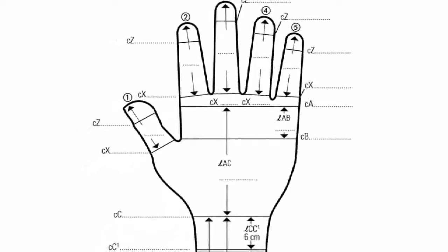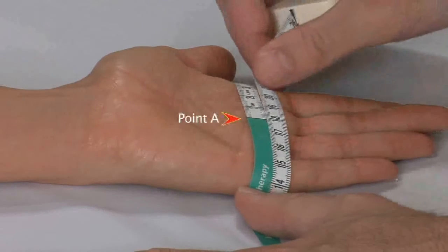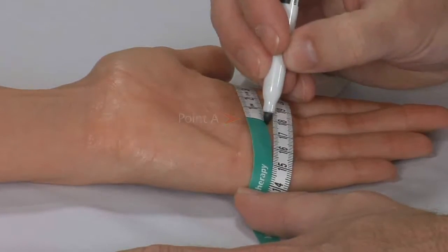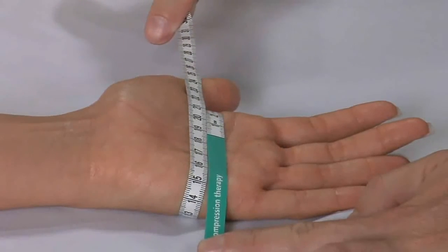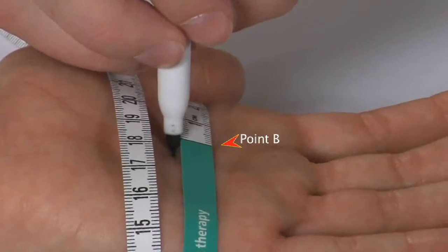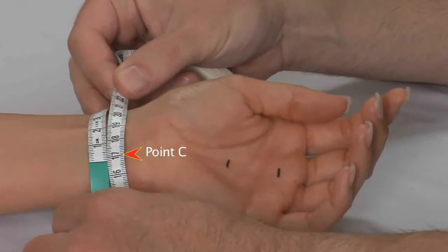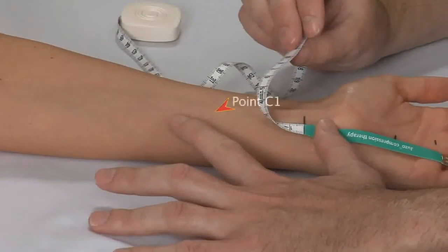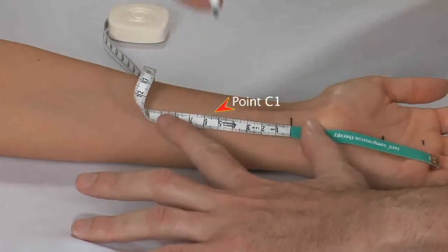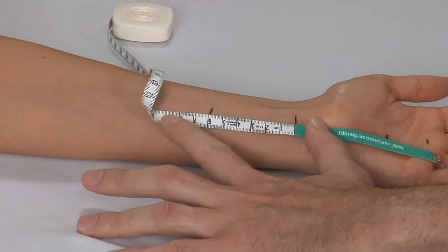There are 4 circumference measuring points around the hand and 2 circumference points on each finger. Start with hand circumference point A, found across the base of the 5th metacarpal and runs perpendicular to the fingers. Next, measure circumference point B, at the base of the thumb, starting inside the thumb web and running parallel to point A. Point C is the smallest circumference around the wrist. C1 is usually taken 6 centimeters up the arm from point C. However, if the patient will need a shorter or longer wrist extension, just cross out 6 on the form and write in the correct length and take the circumference at that point.